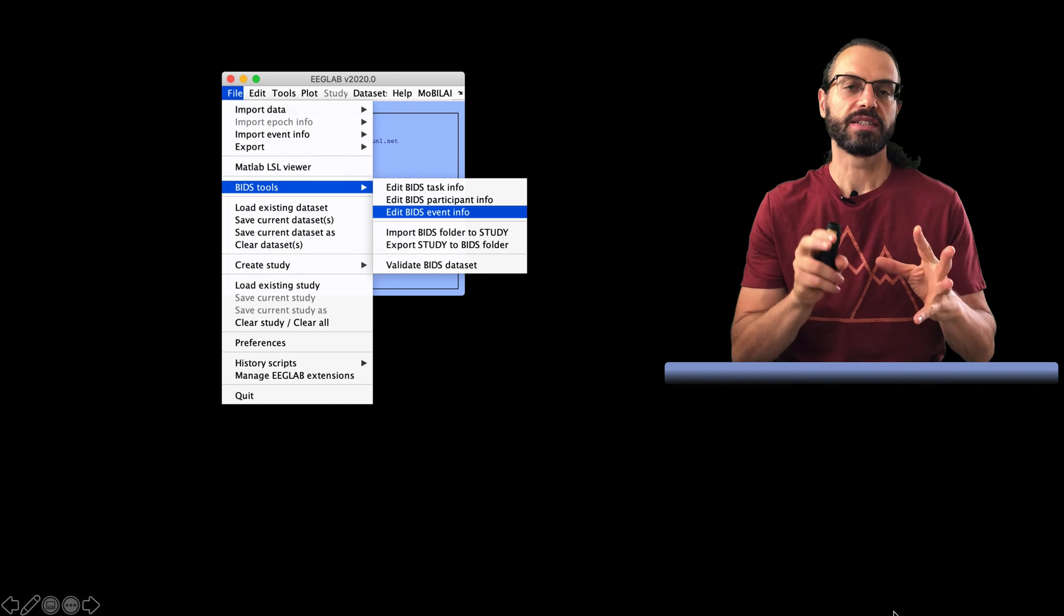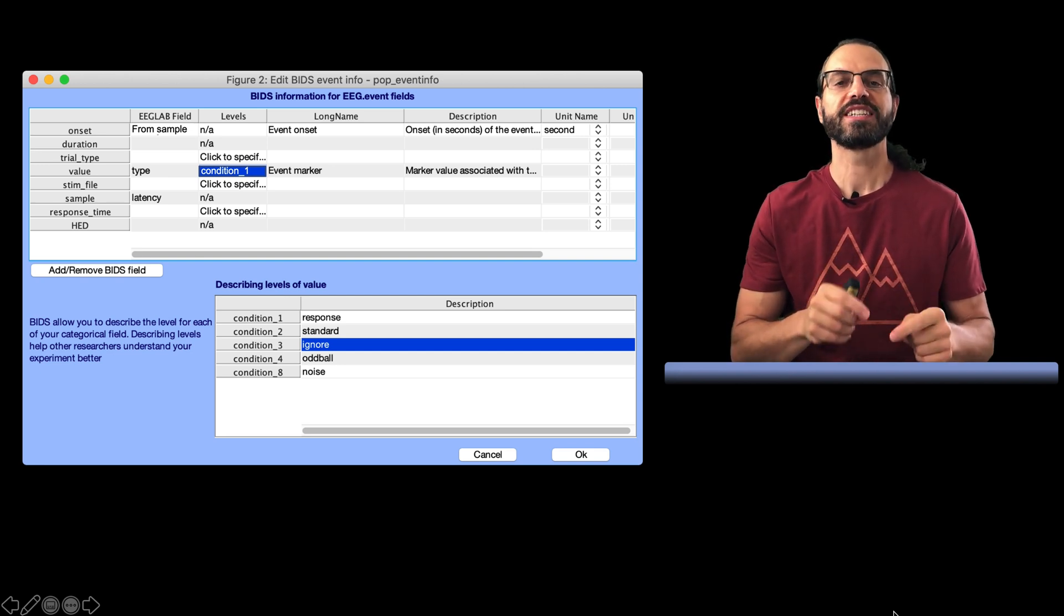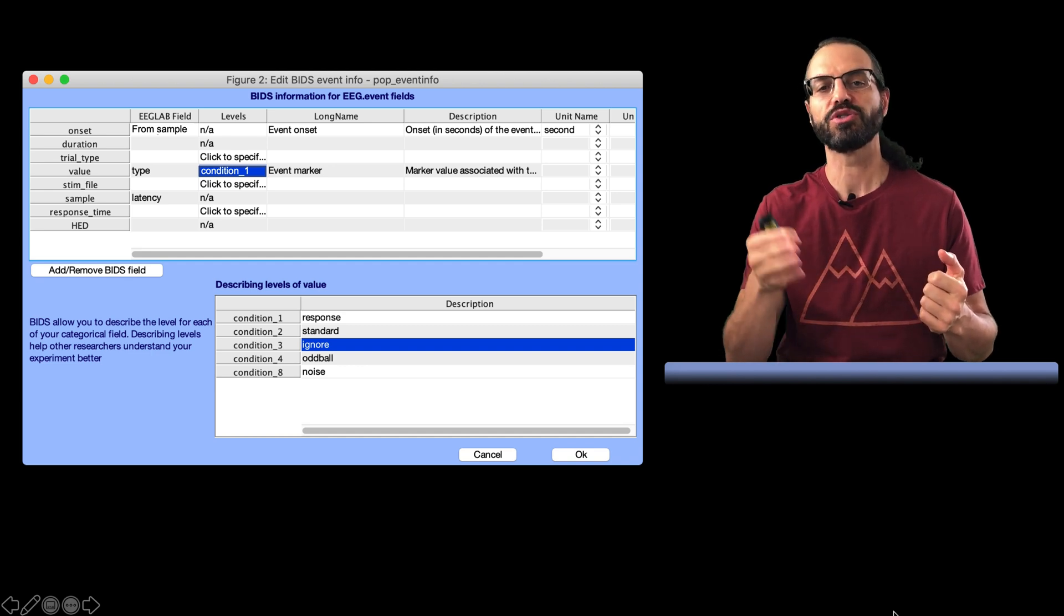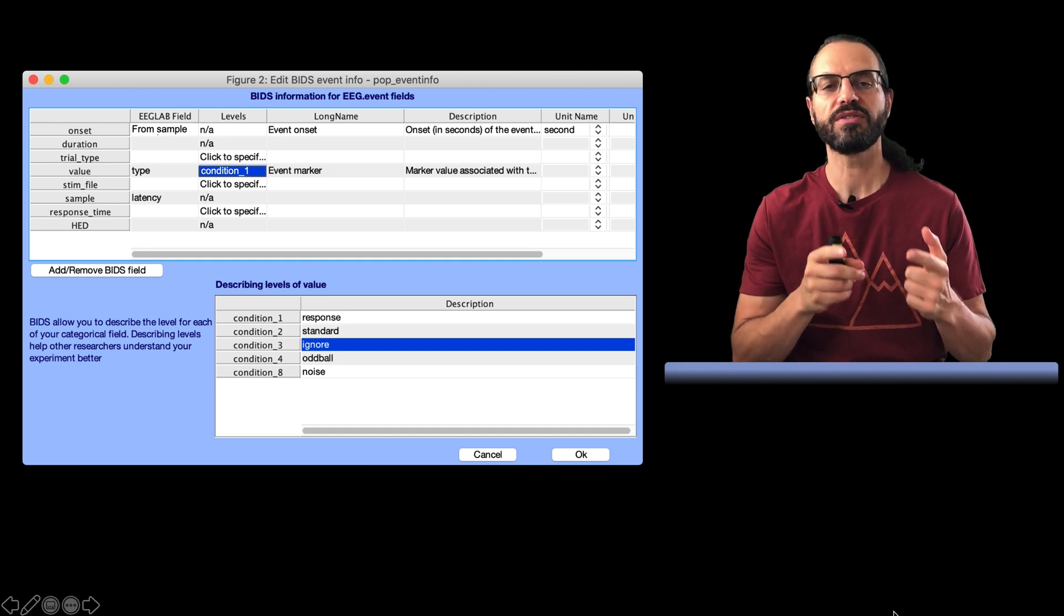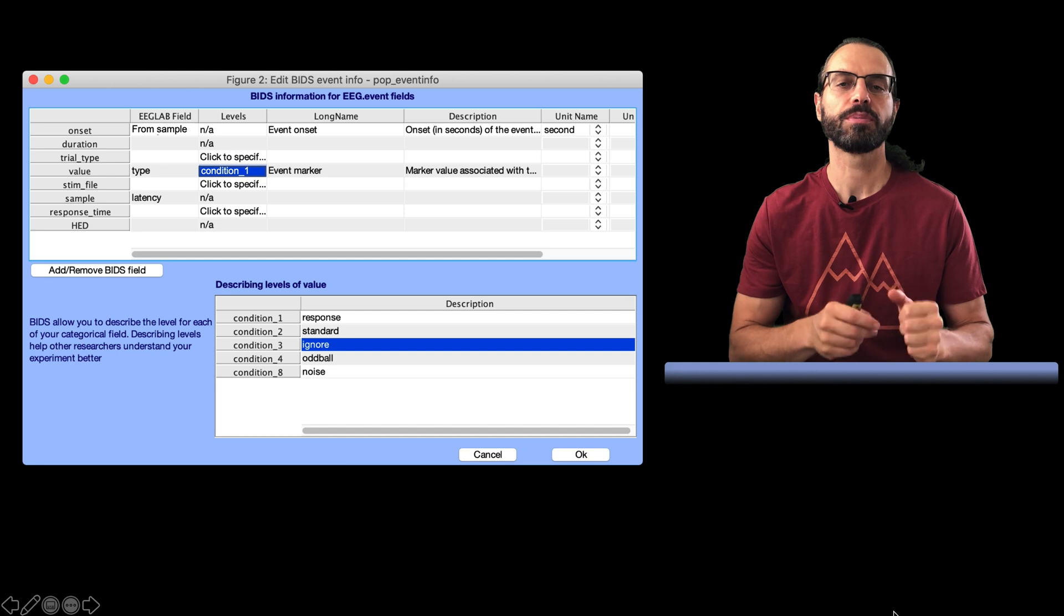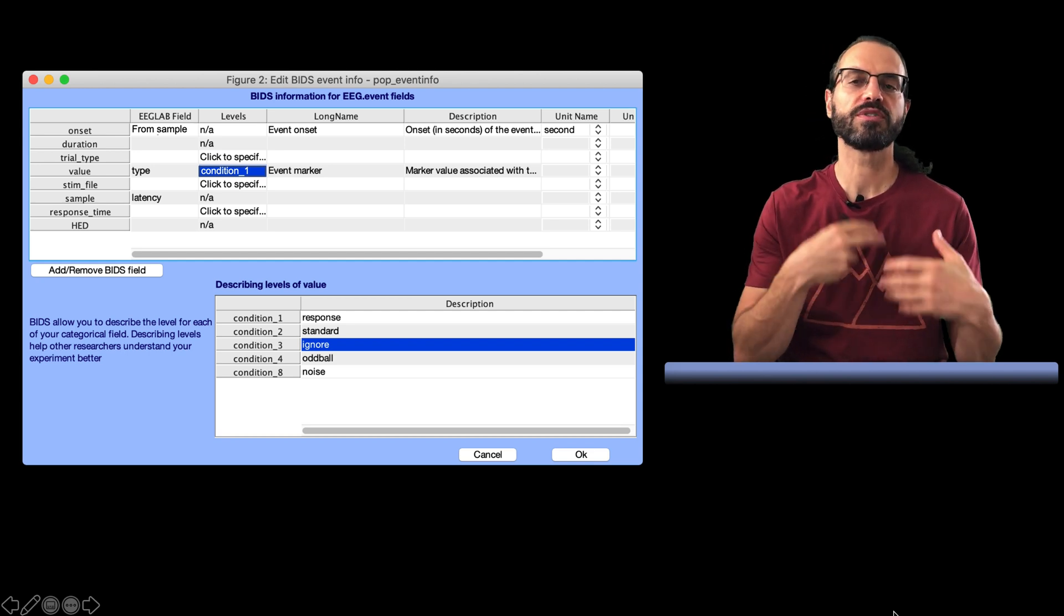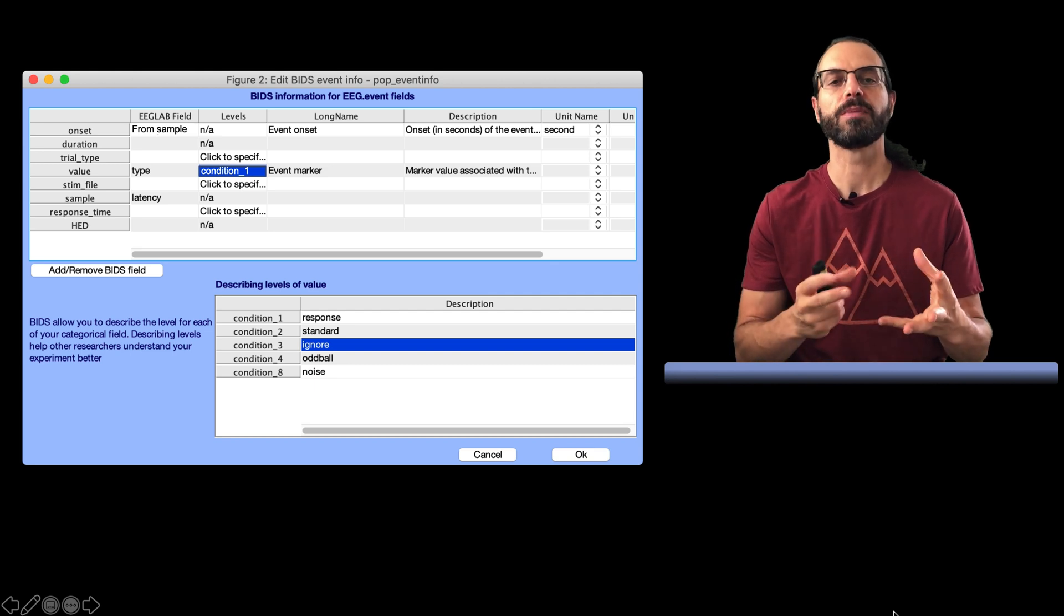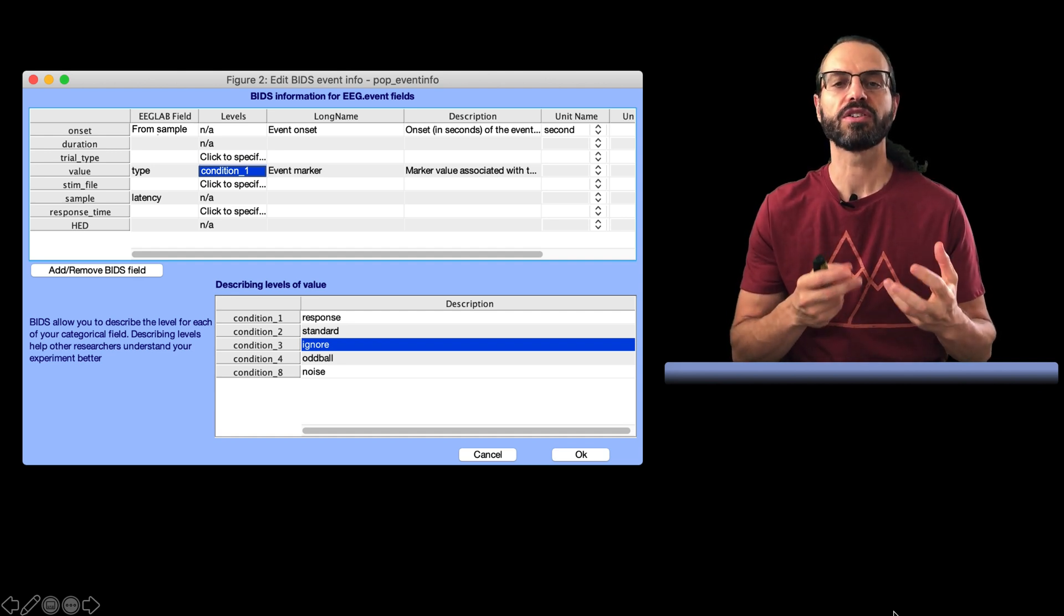Then let's look at events. This is the next menu on the list. So here I select the EEGLAB event fields for each BIDS event column. If it is empty, it's fine. Onset corresponds to the latent field of EEGLAB, although this field is in sample. It is converted to second here from the sample field. Then we have BIDS event duration, usually associated with the EEGLAB duration field if it is present. Then we have the BIDS sample field, which is equivalent to the EEGLAB latency field. Then we have trial types, which can be, for example, stimulus or response. Then we have response time, for example, when you have a reaction time to stimulus. Then we have a stim file, which may contain the name of the stimulus file stored in the stimuli BIDS folder. Finally, we have the value field, which is the value associated with the event. Here our event can take values 1, 2, 3, 4, and 8, and they are stored in the type field of EEGLAB.